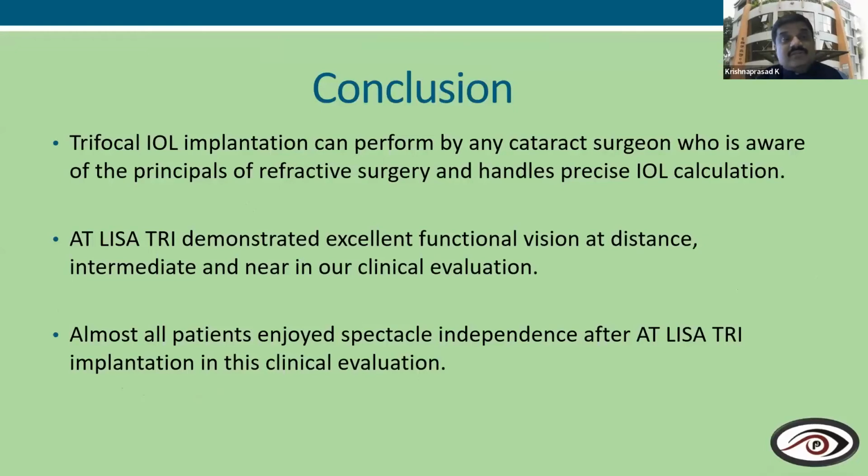In conclusion, trifocal intraocular lens implantation can be performed by a cataract surgeon who is aware of the principles of refractive surgery and handles the precise intraocular lens calculation. AT-LISA TRI demonstrated excellent functional vision at distance, intermediate and near in all our clinical evaluation. Almost all patients enjoyed spectacle independence after AT-LISA TRI implantation in this clinical evaluation.